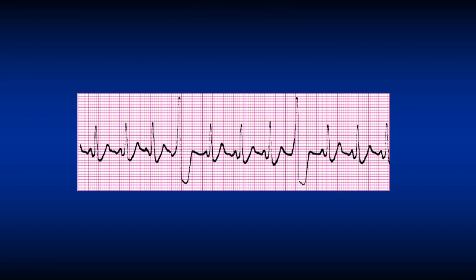Here we see three normal sinus beats, then a PVC, three normal sinus beats, then a PVC, and again this pattern continues throughout the strip. This repeating pattern is called quadrigeminy.